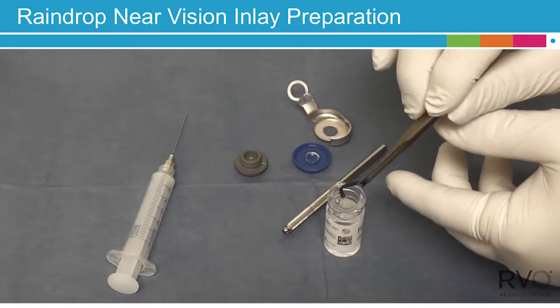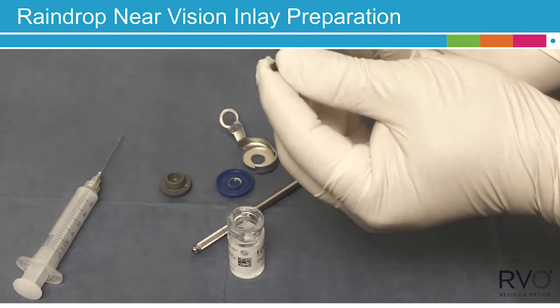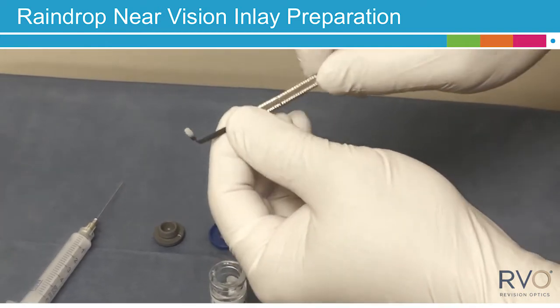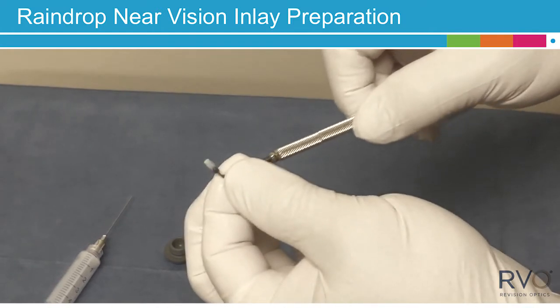Be careful not to contact the Raindrop inserter cap with the inside of the glass vial. Place the Raindrop inserter into the round hole of the Chuck handle and then twist the Chuck handle to tighten the assembly. Gently tug on the inserter to confirm the assembly is secured.